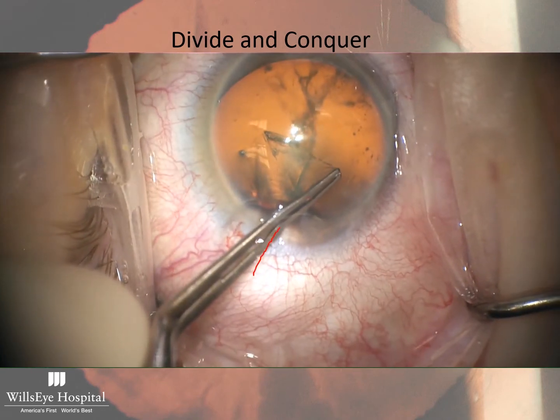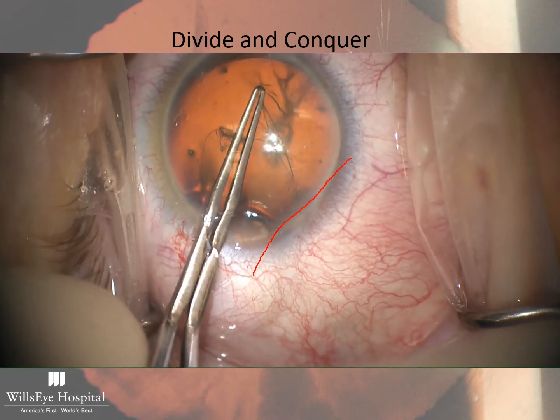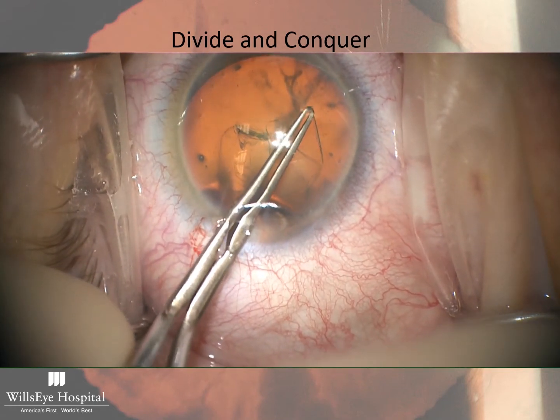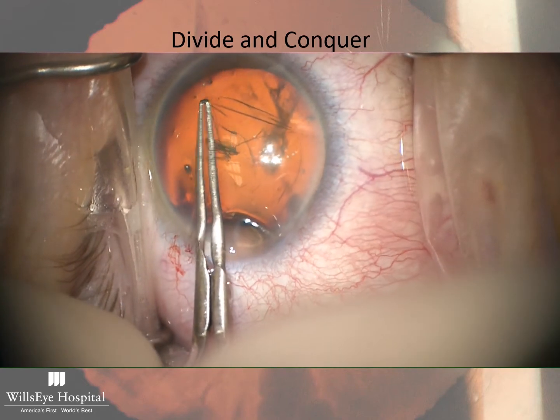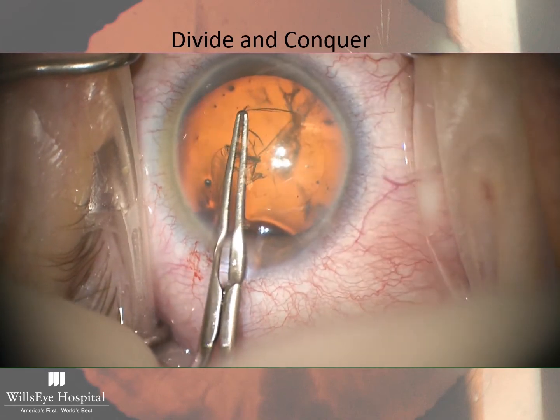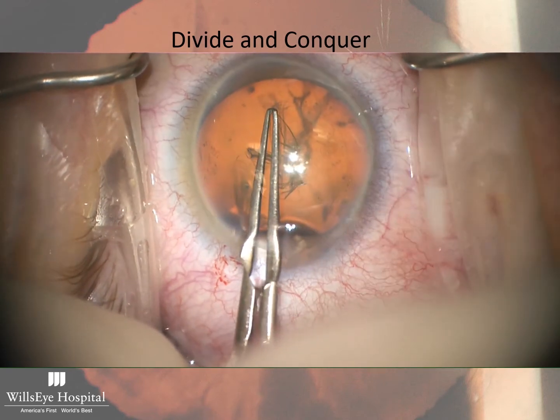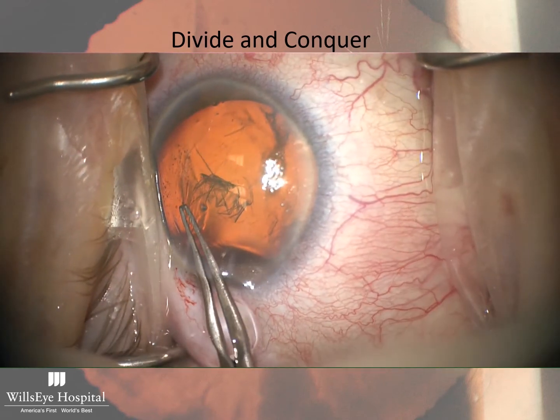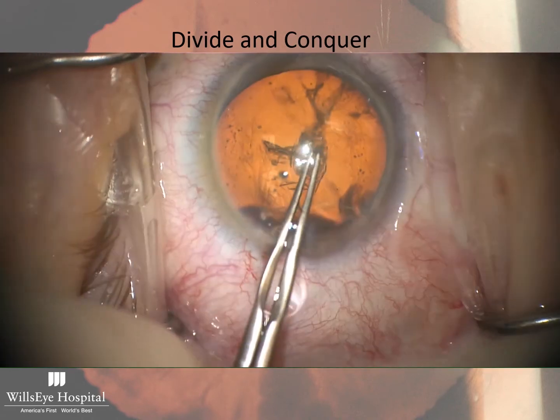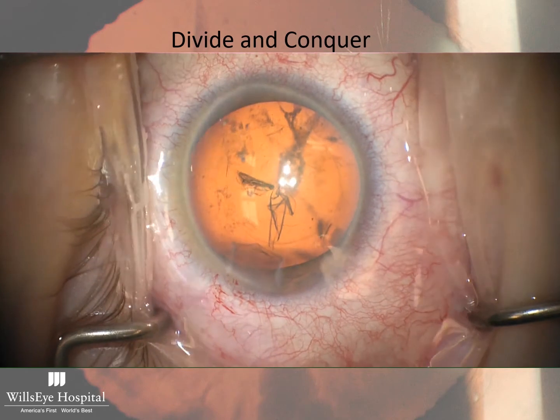And you can see me twisting in the wound to drive the edge of the capsule or the rhexis around so that I'm not needing to re-grab subincisionally each time I reset my capsule when I grab with the Utrata forceps. And again, when I went in with the forceps, I turned to the side. So when I reset, it allows me to lay the flap over and grab appropriately. And then finish by pulling centrally here. So I'm pretty happy with my rhexis.